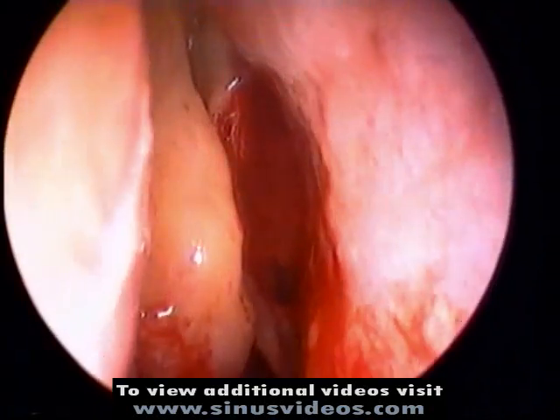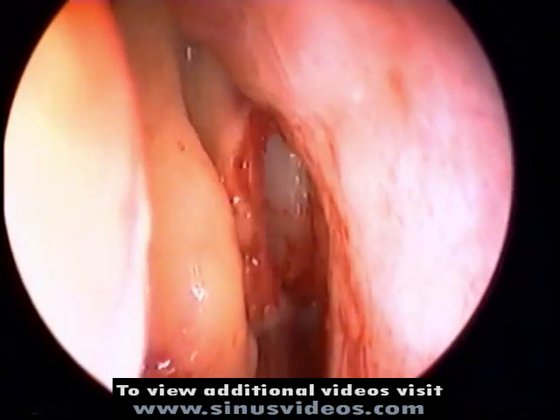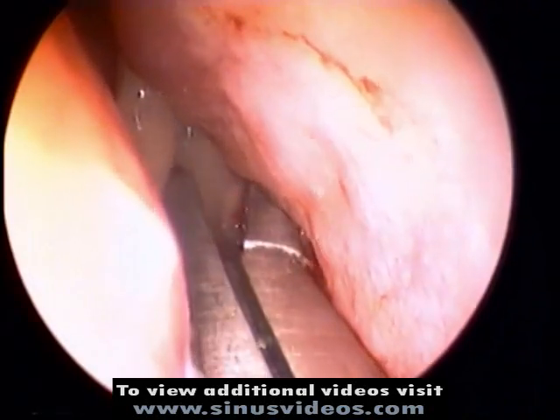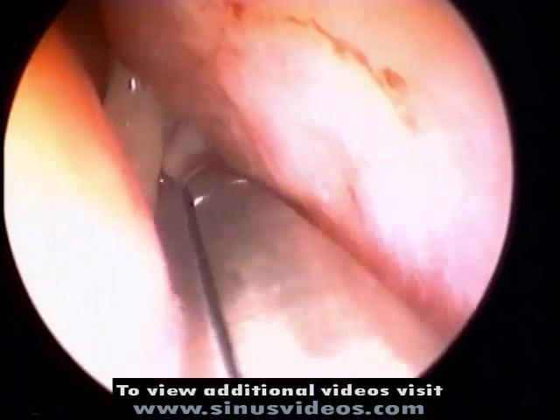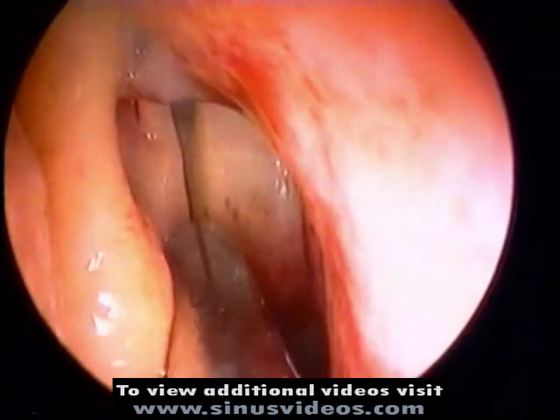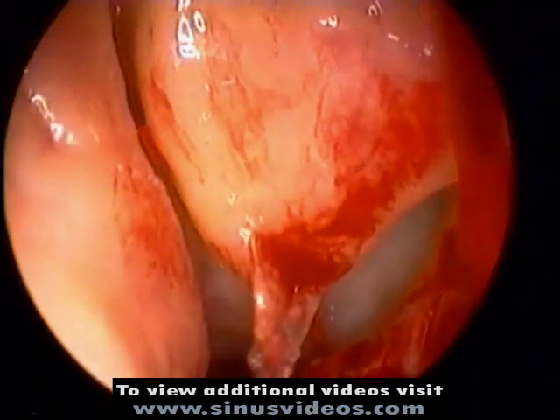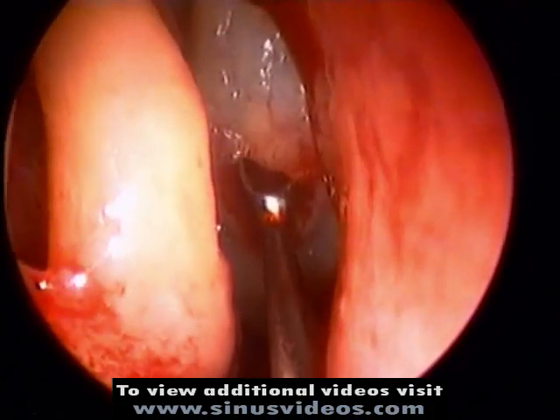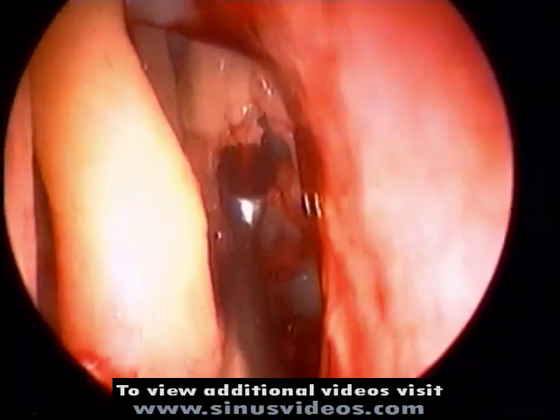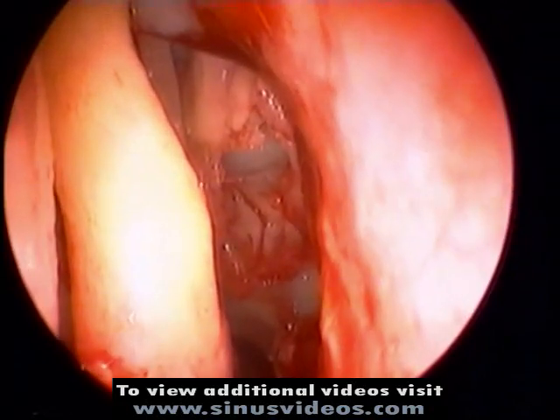The uncinate process is reflected in a medial direction to expose the infundibulum. The uncinate process is then grasped along its superior attachment with the Blakesley forceps, which is rotated. Once the uncinate process has been removed, the ethmoid bulla as well as the maxillary ostium are evident. The ethmoid bulla is entered with a small spoon curette to reveal normal appearing mucosa within the ethmoid sinus.